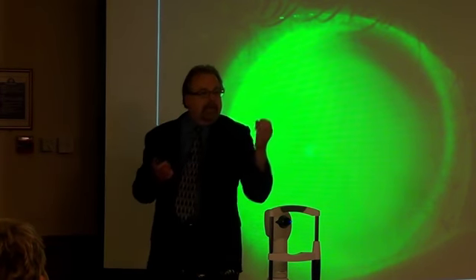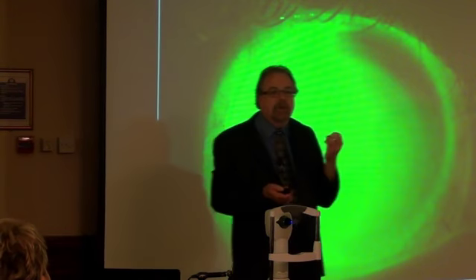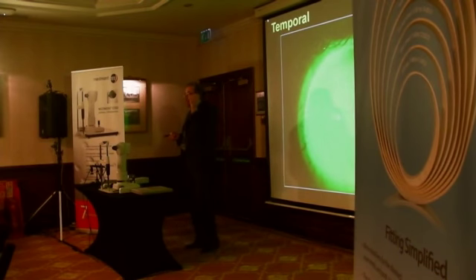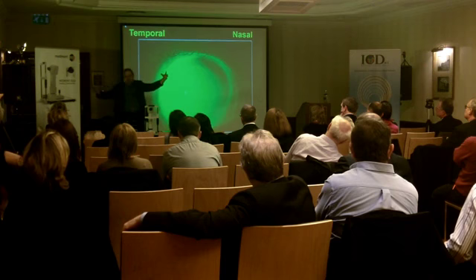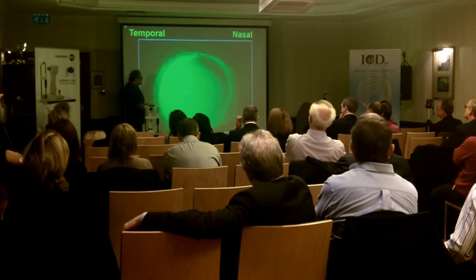These smaller diameter scleral lenses tend to drop about 1/4 of a millimeter on the eye. And that is the fact that they're just not supported by all of that plastic in the periphery, as you would see with an 18, with a 22 or 24 millimeter scleral lens.